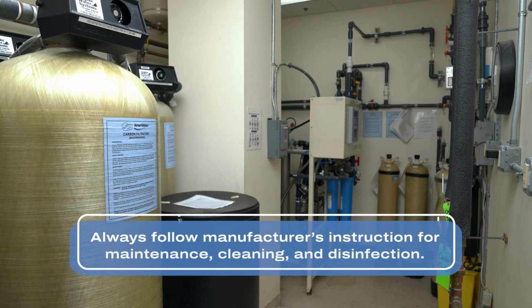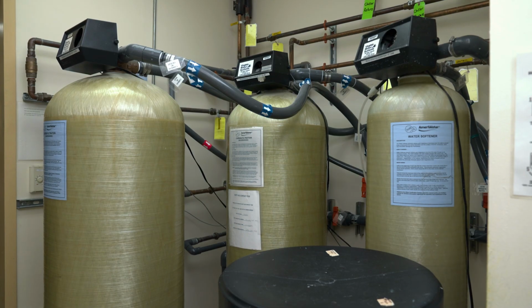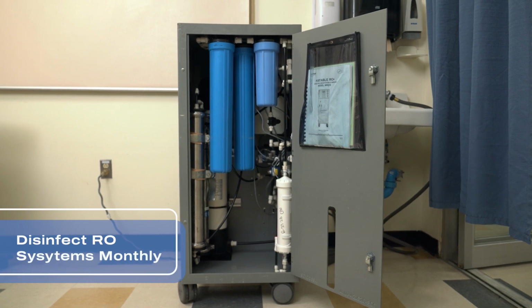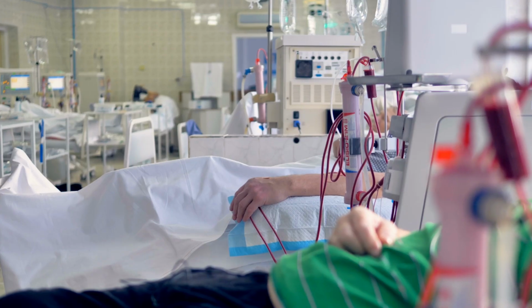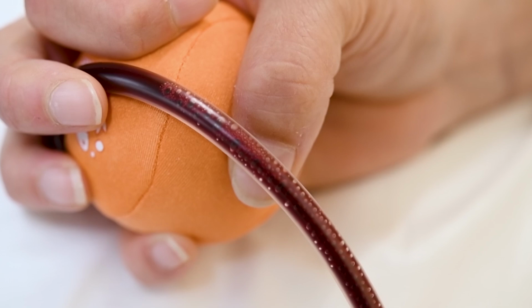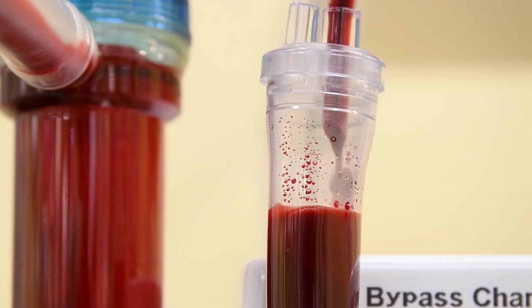In addition to proper testing procedures, it's also important to regularly disinfect the water treatment machines. The water distribution loops, main RO, and portable ROs should be disinfected on a monthly basis. Ensure that carbon filters are changed per manufacturer's recommendation. For the safety of your hemodialysis patients, it's imperative that water samples are collected in both a proper and timely fashion to ensure that the treatment water maintains safe and healthy levels.